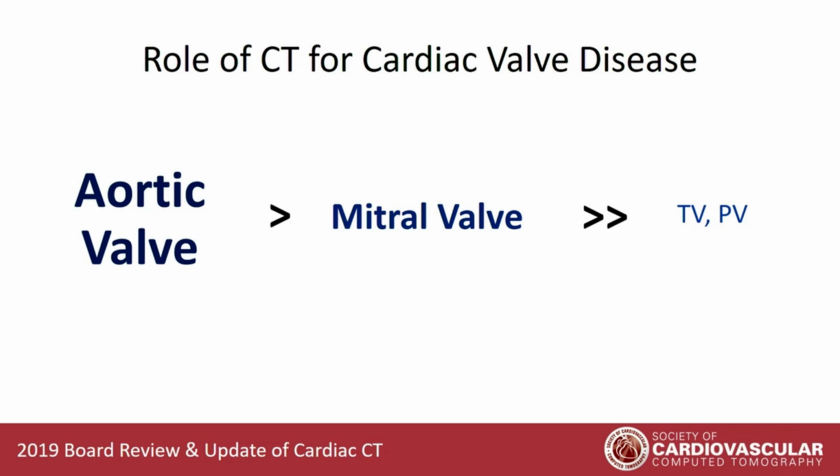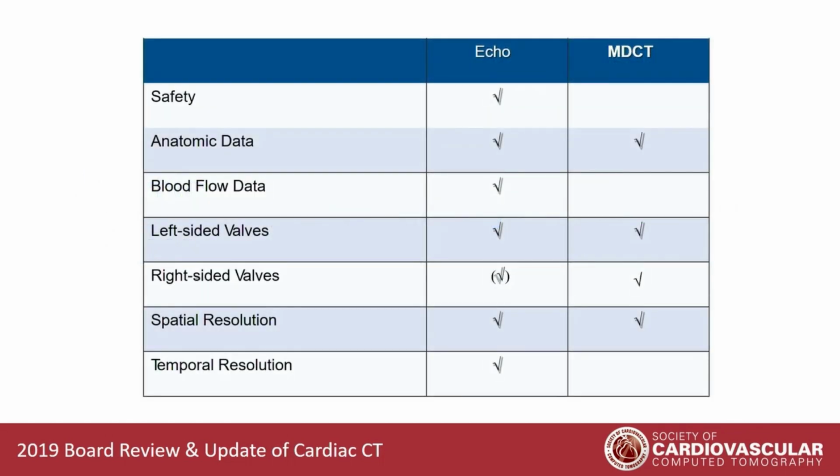A little bit further behind this, I think the tricuspid valve is looming in the future, right? We've started to do a little bit of tricuspid valve CT at our institution. The pulmonic valve, unless you're a site that is part of the Harmony trial or the Melody trial, you may or may not see a lot of pulmonic or pulmonary valve CT. Again, there's some individual variation, but in general, this is kind of our strata, our hierarchy, if you will, of the evaluation.